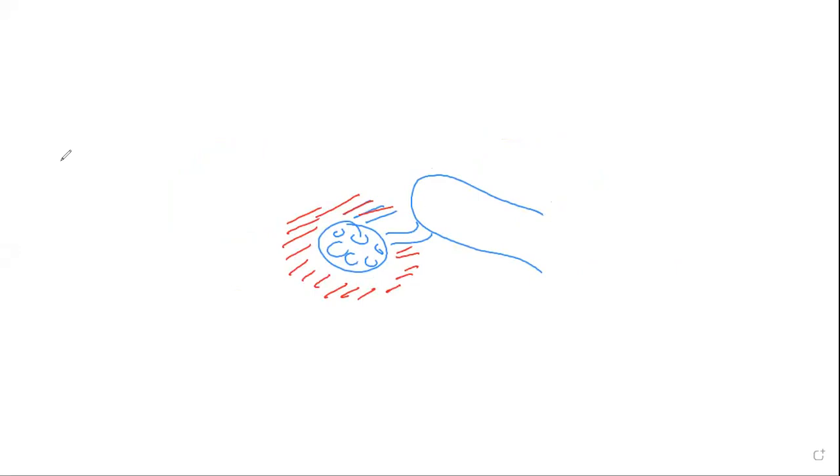And then there is organization of the fluid, and there is fibrin, inflammation, and septation, that is the fibrosis. Okay. And I see this around it. So here there is fluid as such. There's fluid around the ovary. There's adhesions and synechia.